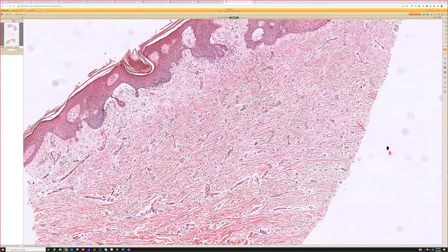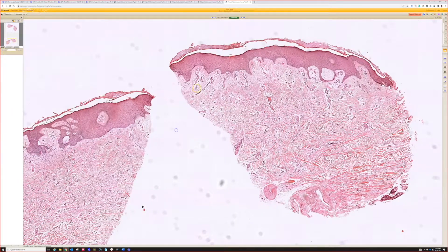This form of DF tricks people — a lot of times people want to think this is scar too, because it's kind of cellular and fibrotic like a scar, but it's not as parallel as a scar usually is. And again, the epidermal change can be helpful.